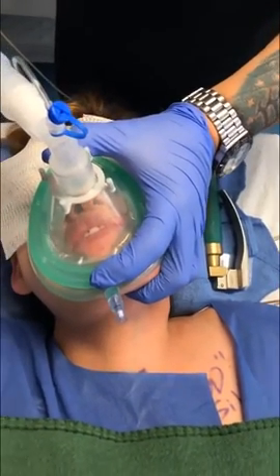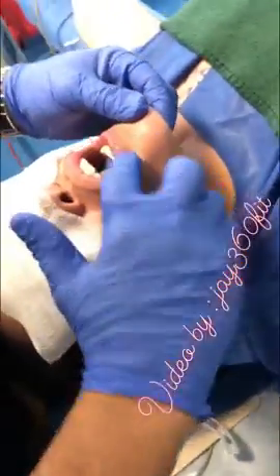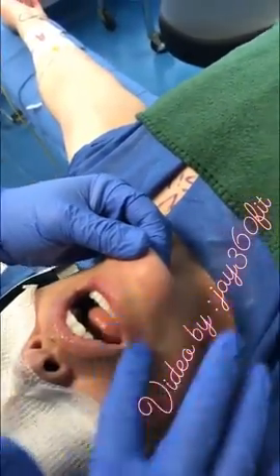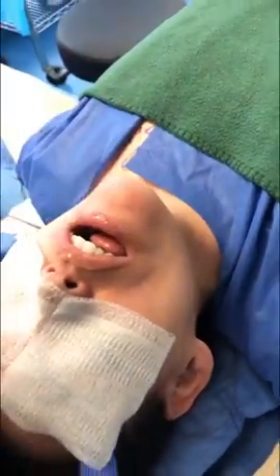That's awesome work, Barry. Thank you, sir. All right, so I want to show you a little hack that I do. You notice her lips are really, really cracked and dry. So I take some lubricant that's on my endotracheal tube and I just put it here on the lips so that we don't further damage her lips when we go to intubate her.